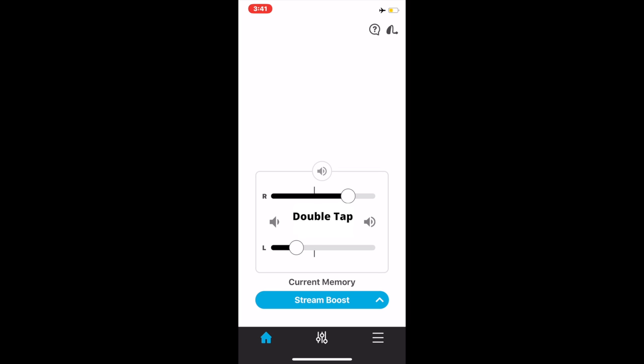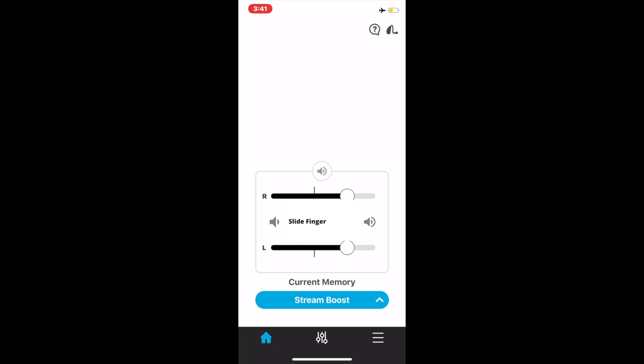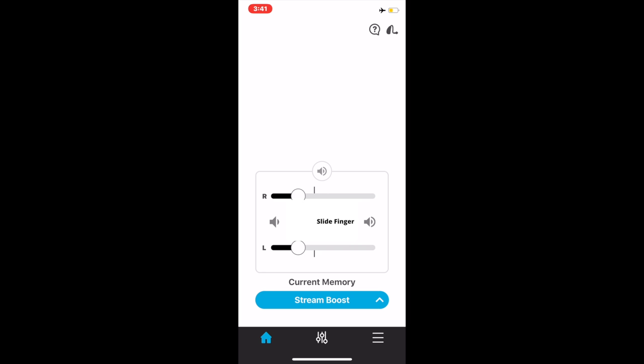If you double tap in the center of the two, it will bring it back to prescribed settings. You can also adjust both the right and left ear together by moving your finger in the middle of the two lines.